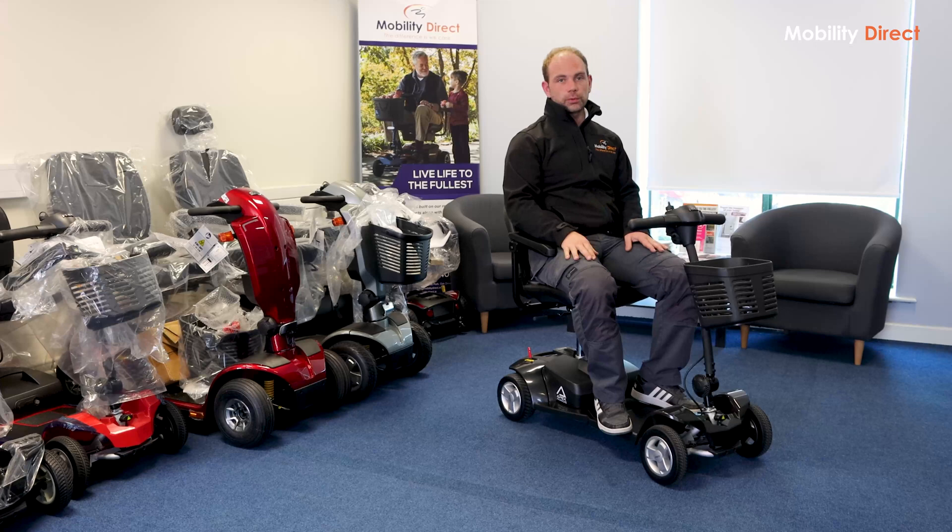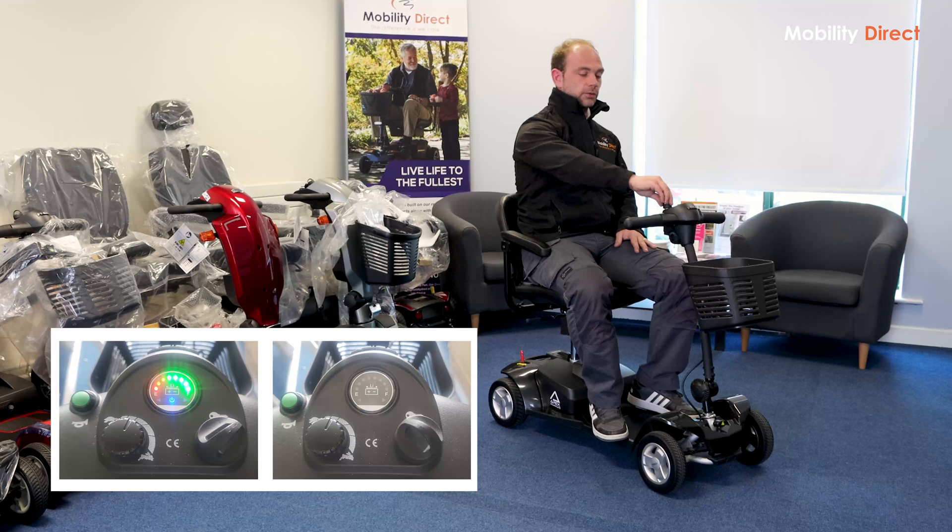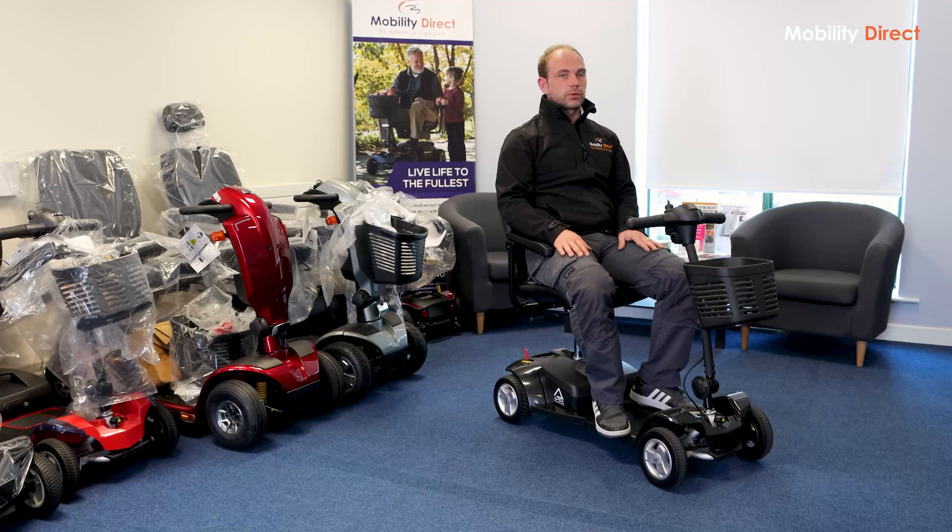For the next part, you want to turn the scooter on, and we do that by turning the key on the front to the right. You turn the key to the right and the scooter is now on. You know the scooter is on because there's a battery light indicator that lights up once the scooter is on. To turn it off, turn to the left. Turn to the right and the battery light lights up — you know the scooter is on.